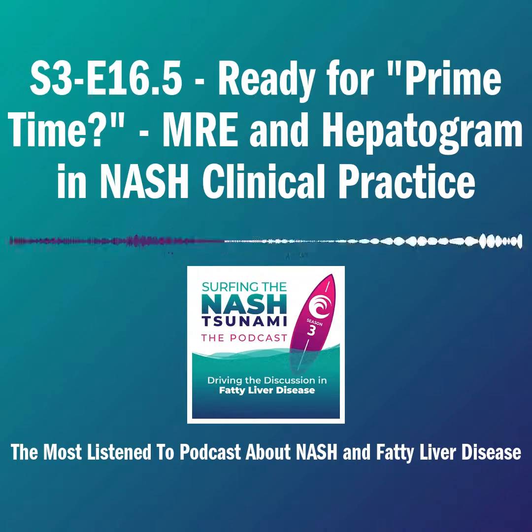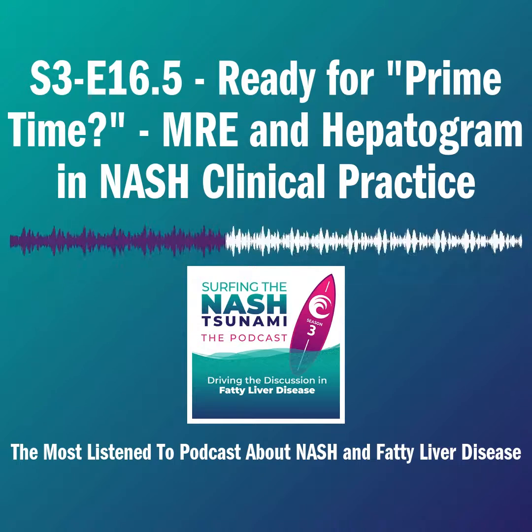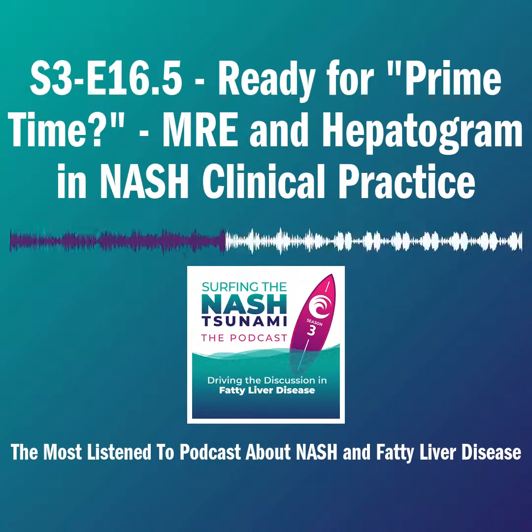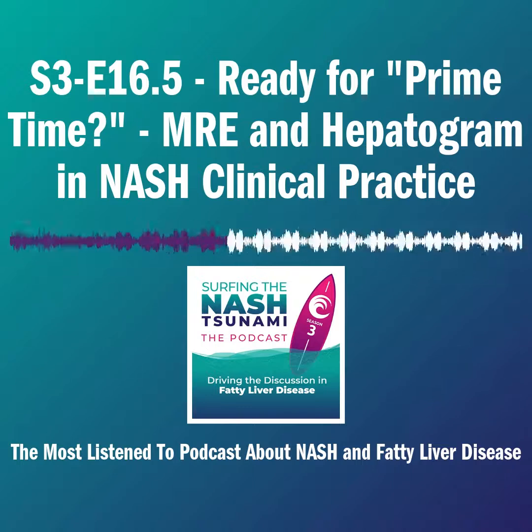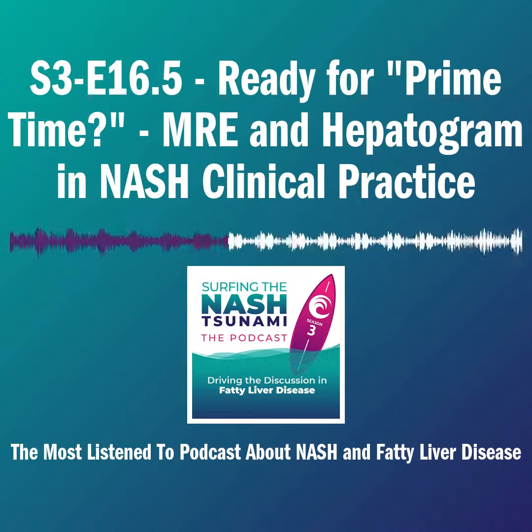MRE is actually quite widely available. There's approximately 2,000 MRI scanners globally that have MRE available, 1,000 of those in the US. We estimate that about 95% of NAFLD patients living in the US are within a 1-hour drive of MRE. So if MRE is not available at your institution, ask for it. Like Scott said, most radiology practices want to be responsive to clinician requests.